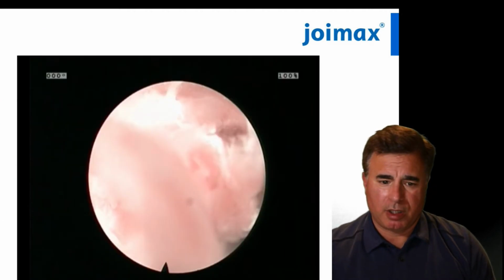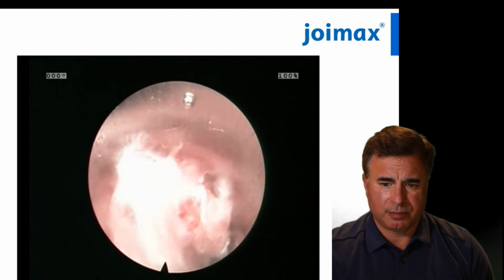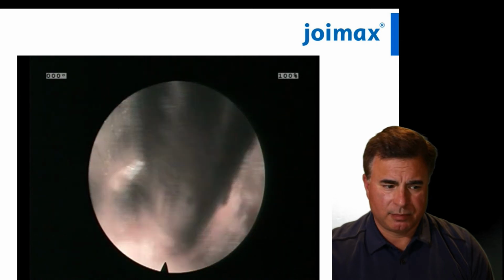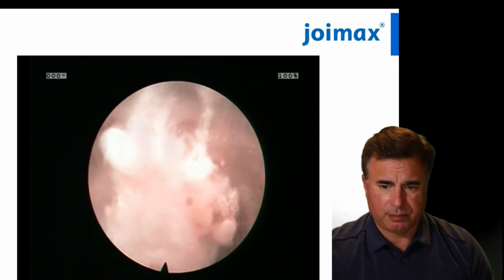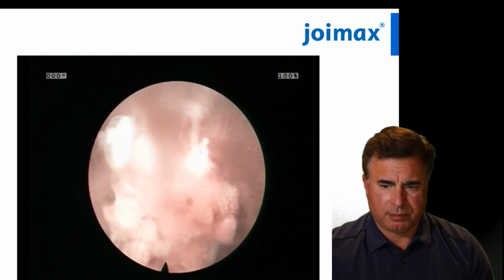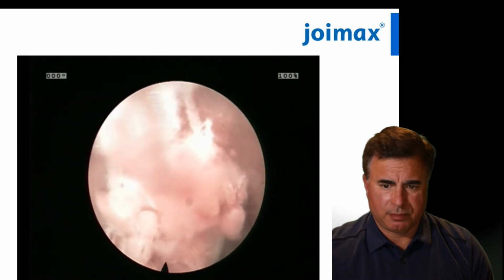So here we are, and I'm going to let this video play and you can listen to it. The endoscope is now into the spinal canal about the midline, and this actually is all the disc herniation right here because I know the dura is being protected at the 6 o'clock. Take that. I see some epidural fat at 2 o'clock and disc material at my 12 o'clock. Stop recording.